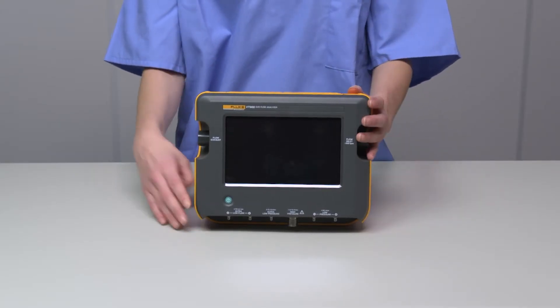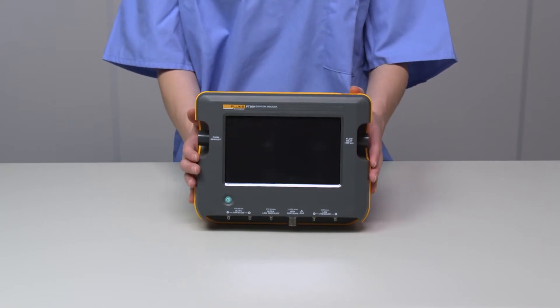We're going to use the VT900 for this video. There are only a few differences between the models, and we'll point them out as we go.